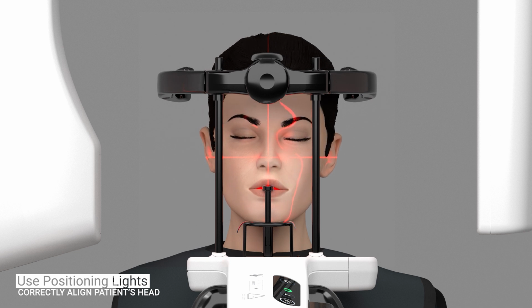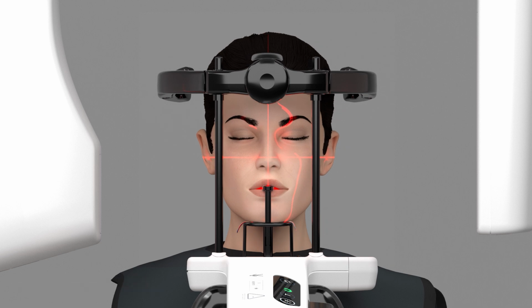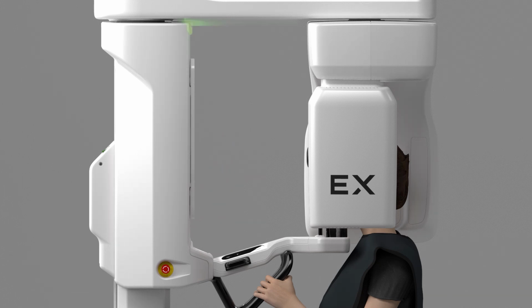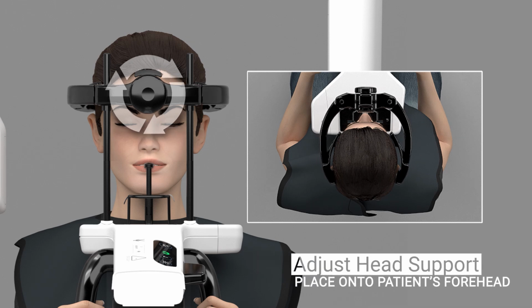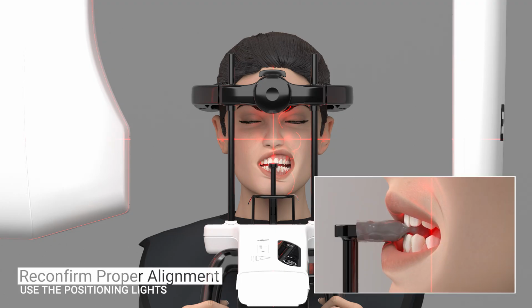Compensate for misalignments by manually moving the patient's head into the proper position or by adjusting the unit height. You can open the mirror and use it to assist in positioning the patient. Close the mirror before you start acquiring an image. Close the head support by rotating the knob clockwise. Adjust the forehead support so it is resting against the patient's forehead. Reconfirm proper patient alignment using the positioning lights.